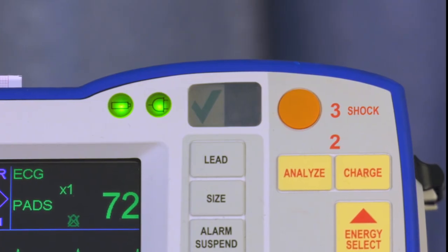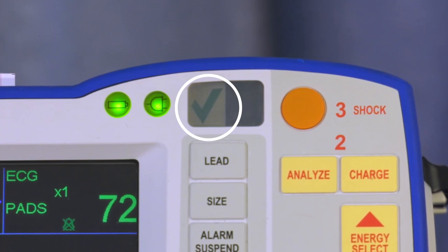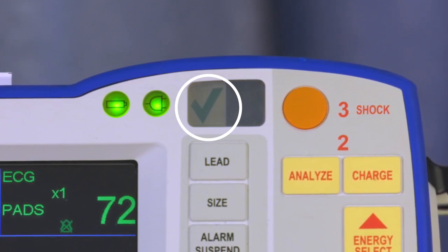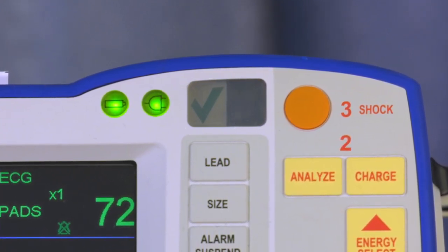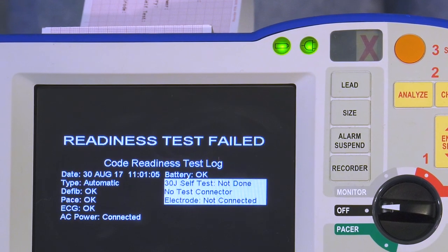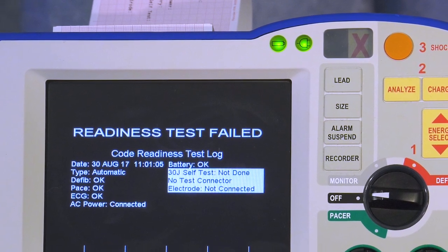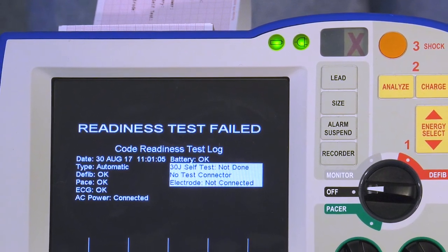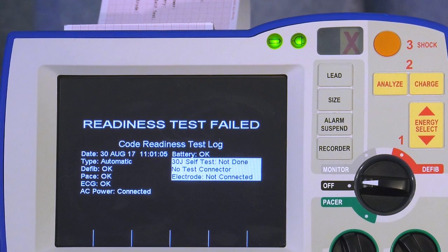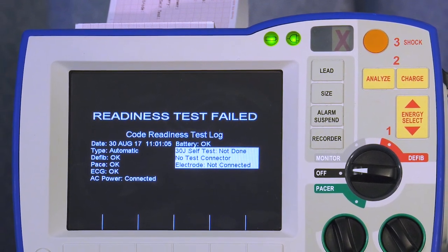After successful completion of the automatic test, the R Series will have a green check mark displayed in the code readiness indicator window. If a red X is present in the window, the R Series did not pass one of the automatic test requirements and a notification will be displayed on the screen. Take the corrective action, such as replacing the expired electrodes, and perform a manual test.